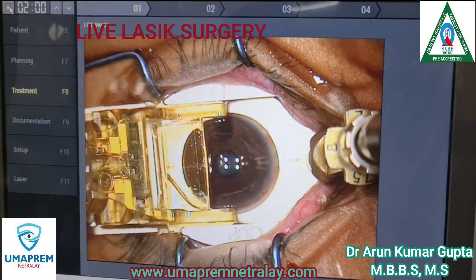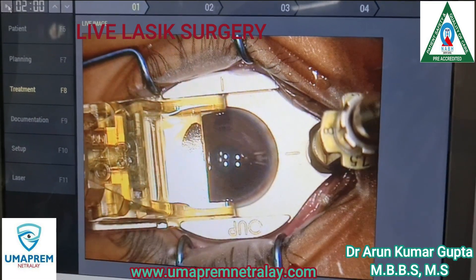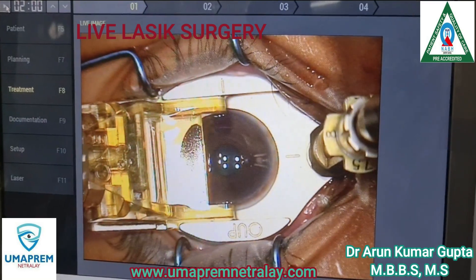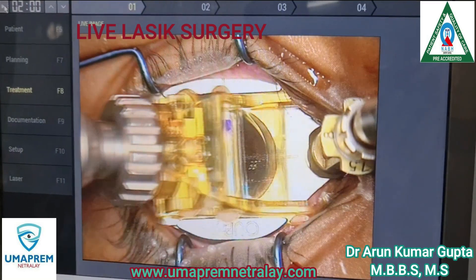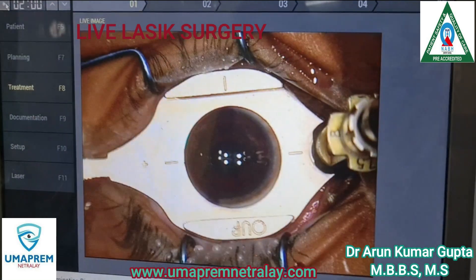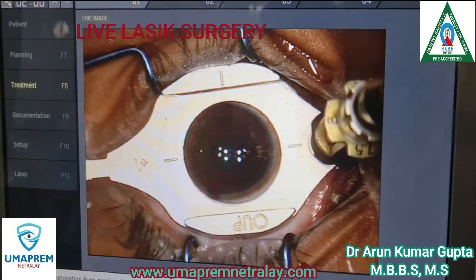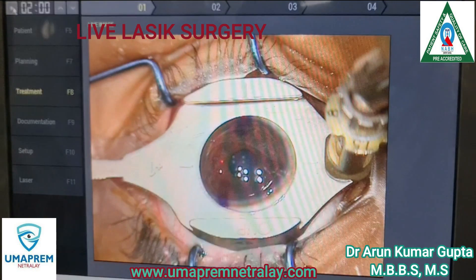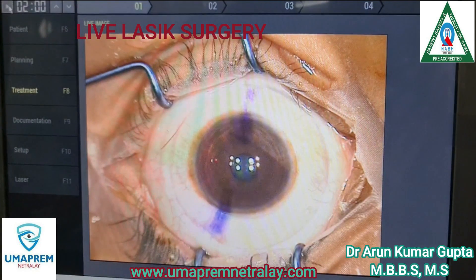You can see here the Kerato. With this Kerato, we made a 90-micron flap thickness. Vacuum is released.